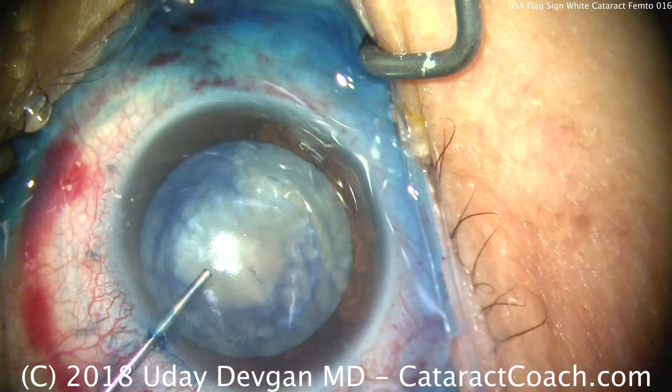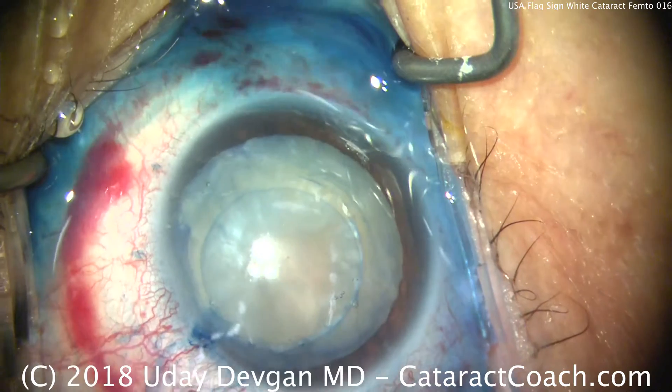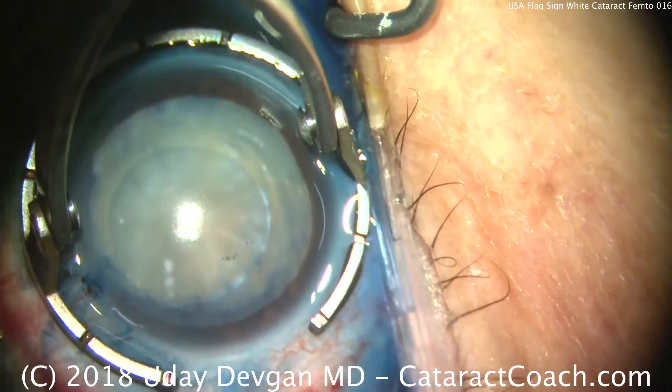The red is the subconjunctival hemorrhage from the suction ring of a femtosecond laser. The white, of course, is the white cataract, and the blue is the trypan blue dye used to stain the capsule.